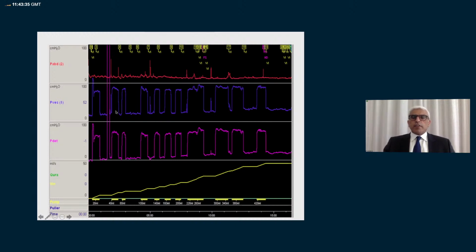the filling is done with the suprapubic. So as the flow goes in, the pressure goes up. You stop the flow to measure the pressure from time to time. And this is the pressure which one needs to take into account for the interpretation in a patient who has got a suprapubic catheter.